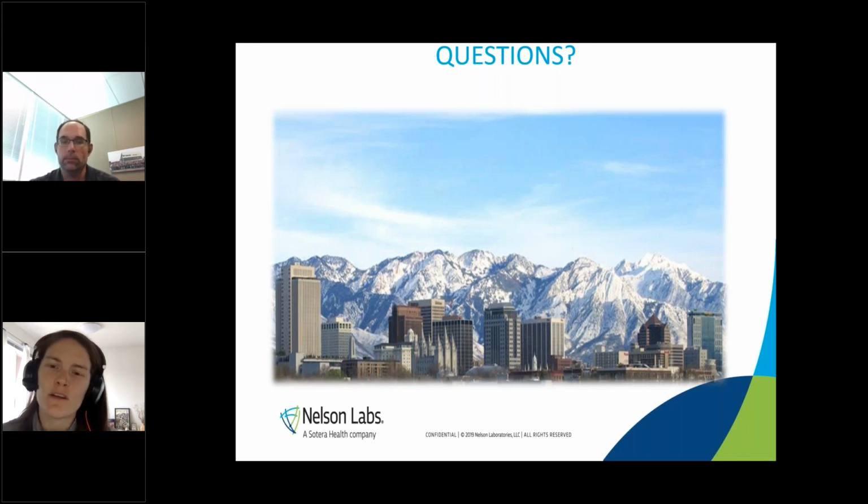We had a question about reusable medical devices. How does the fact that something's reusable pertain to this? The two questions we always think about with reusable devices and biocompatibility is first, can it be used without being cleaned? Is the first use without being reprocessed? If it is, then all your biocompatibility needs to go through that first uncleaned device, because the actual process of reprocessing can remove leachables. It can remove detergents or residuals on there. So if it can be used without cleaning, then we have to do that biocomp first. If it can't, then you want to do a reprocessing run and then test the biocompatibility.